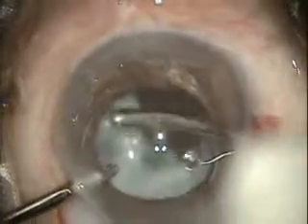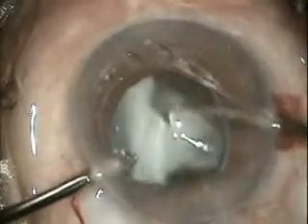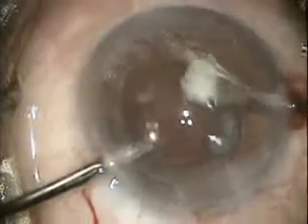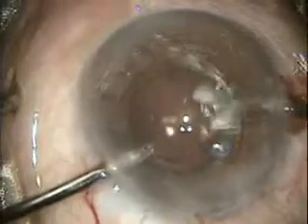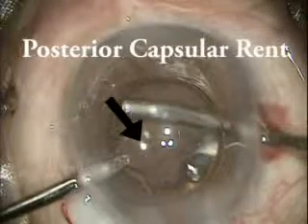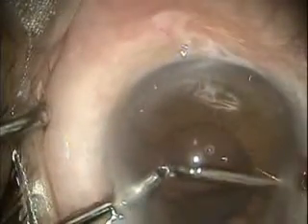Care should be taken that the vitreous is not pulled, and a good anterior vitrectomy should be done if there is any vitreous prolapse in the anterior chamber. We see here there is a posterior capsular rent. After clearance, the lens is being dialed, and very safely a good surgery can be accomplished.